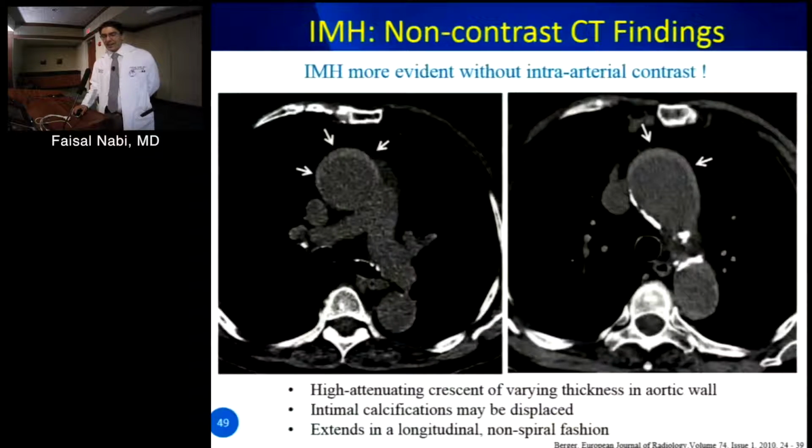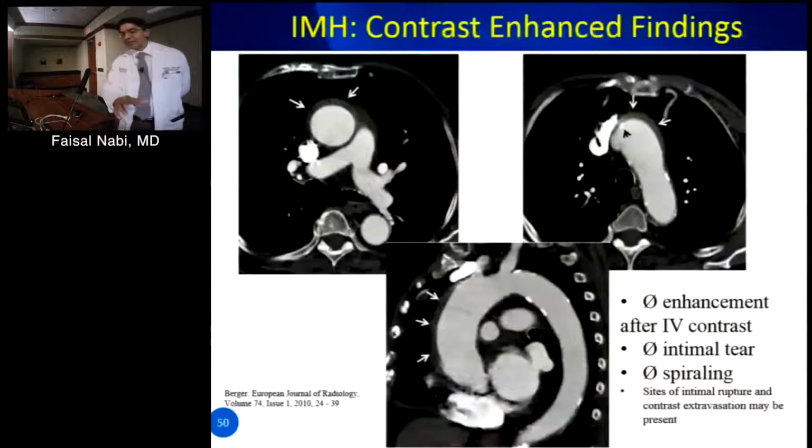Yeah. And actually, Dr. Kia, I wanted to ask you, I have seen a lot of this when I'm doing TEEs, in a patient that has no symptoms or no indication for that. And I've often thought it was fat on the aorta.